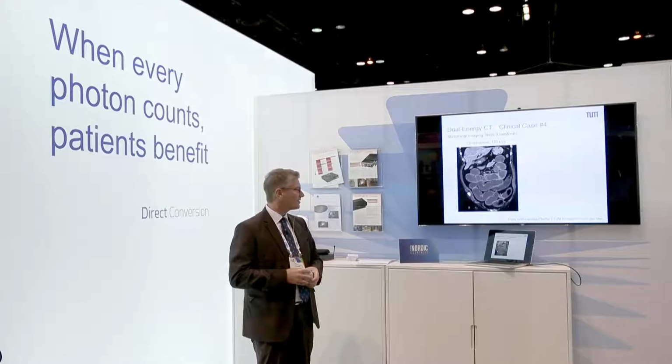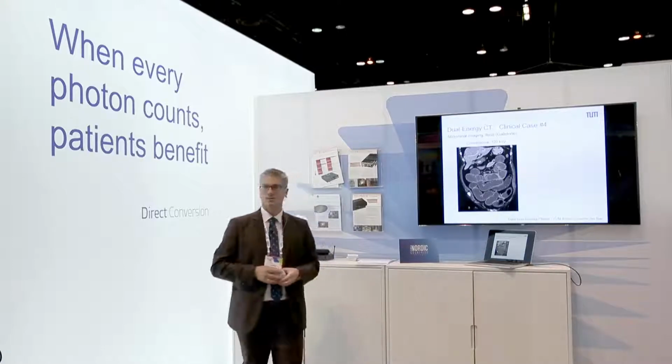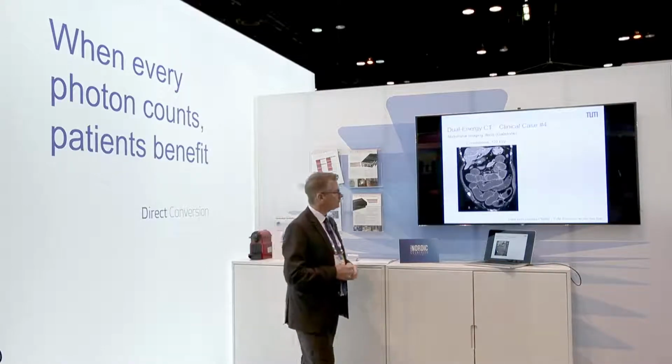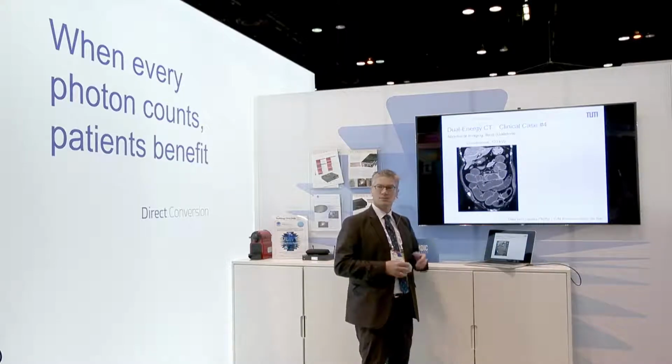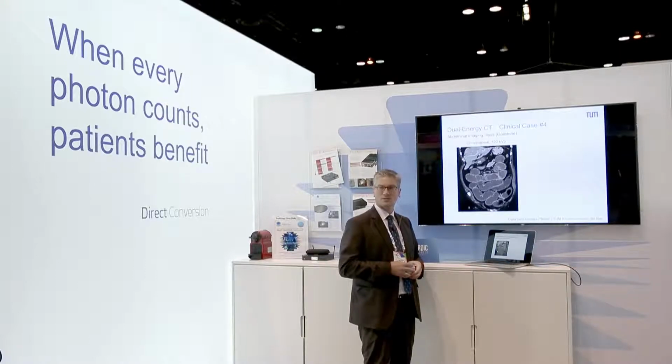That's another thing that shows the usage of Z effective. It's a patient with an ileus. So the small bowel is blocked and filled with liquid. And the task of the radiologist here is to figure out where the obstacle is in the bowel. Do you see it?